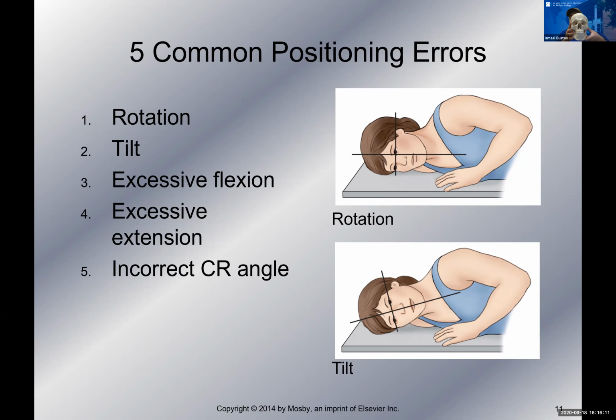All right. So this is the projection of the skull. This is the skull here, right? The skull sits on top of the spine, which is down here, right? So rotation means you're going to be rotating around the spine. And then tilt is you're going against the spine, right? So my head here, if you look at my head, if I'm going this way, I am rotating. If I'm going this way, I am tilting.